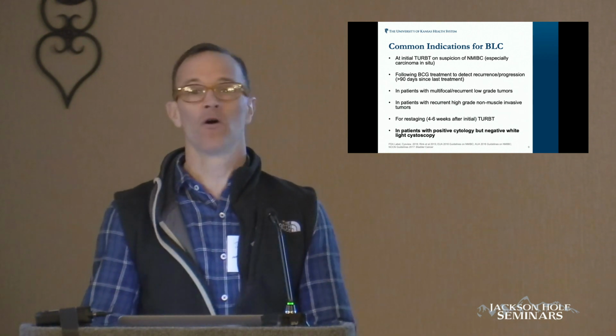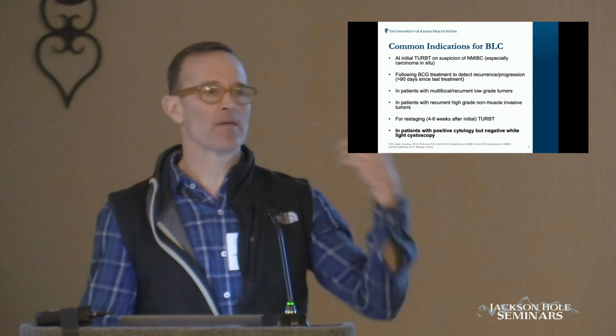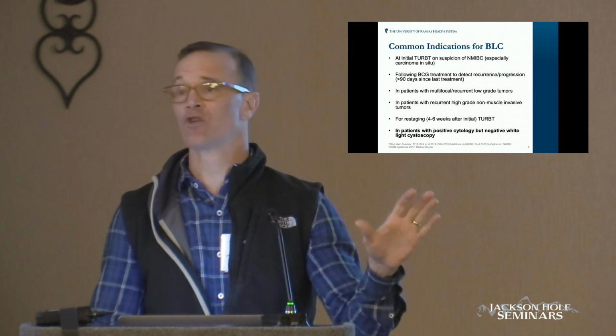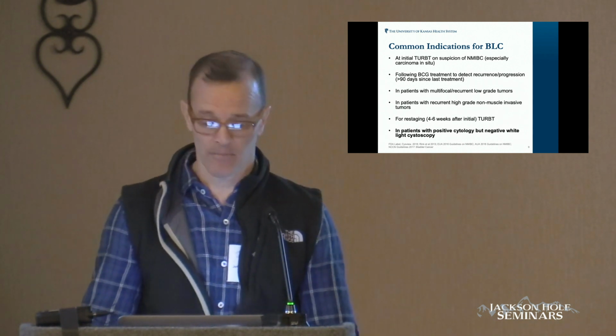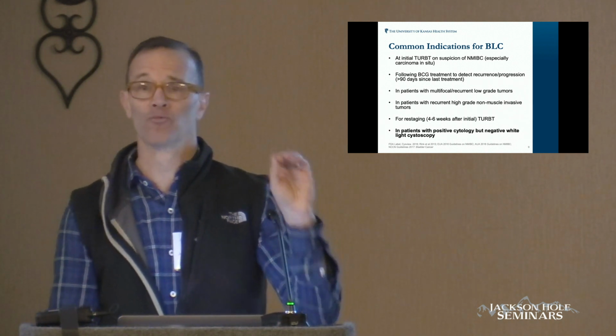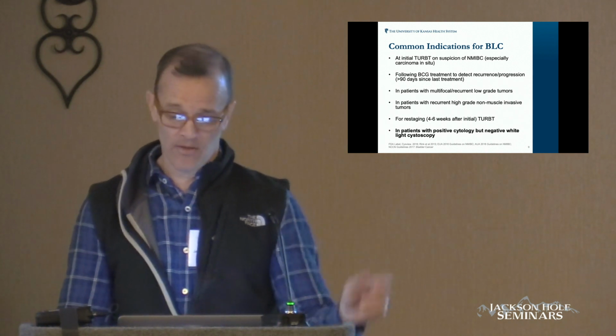In patients with multifocal disease, so people that keep coming back with these recurrent low-grade tumors, that's a great one. I think you're just missing a lot of these tumors, and I'll show you a picture of that in a minute. Patients with high-grade non-muscle invasive bladder cancer that you're really trying to preserve their bladder, I think that's important there.